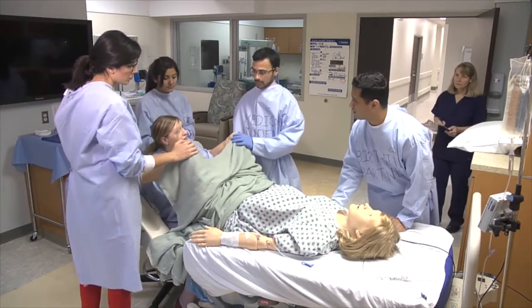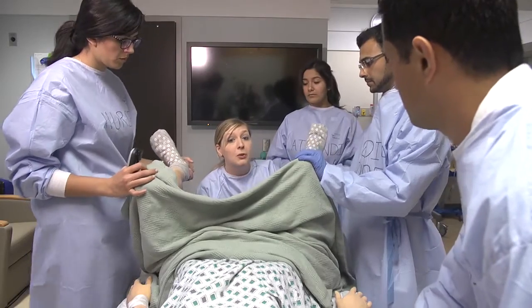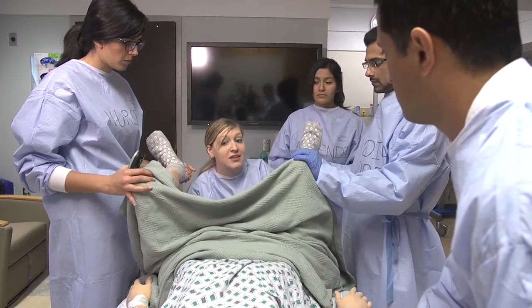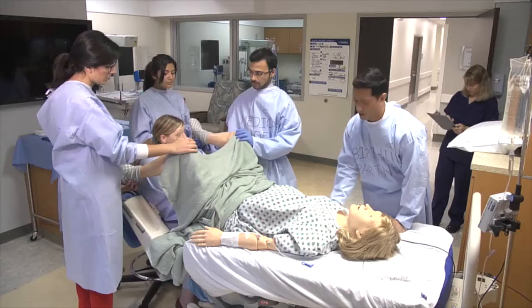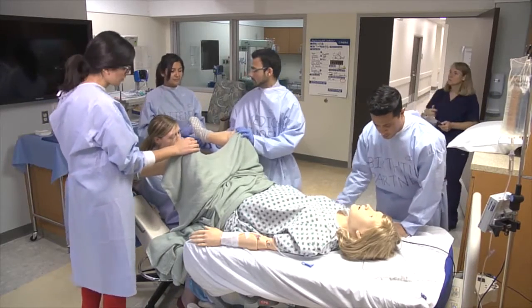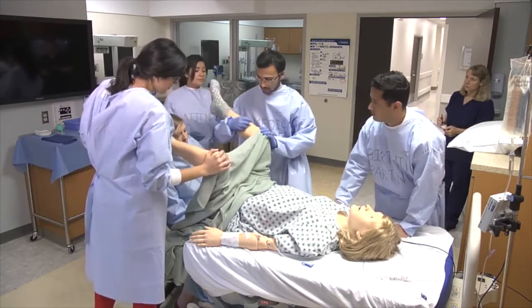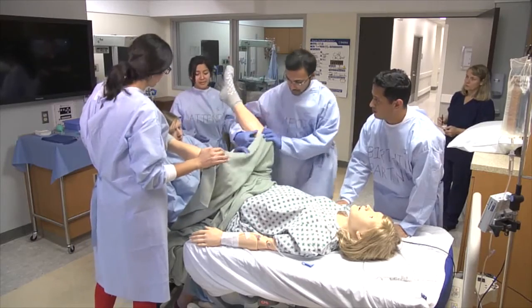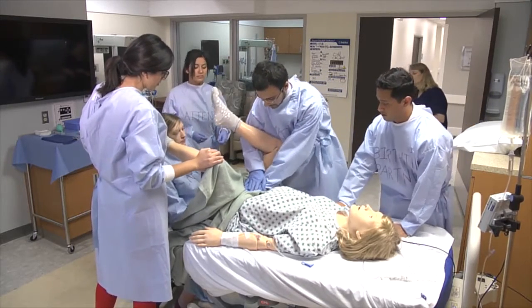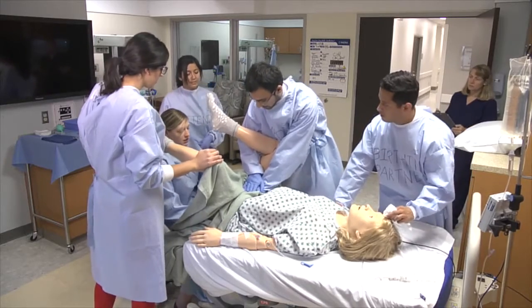What's happening? Why isn't the baby out yet? Sir, we're doing everything we can for Noelle. I need you to tell her to take short panting breaths and to not bear down. Okay, let's get a McRoberts maneuver. I need suprapubic pressure from the side of the med student. It's not working.